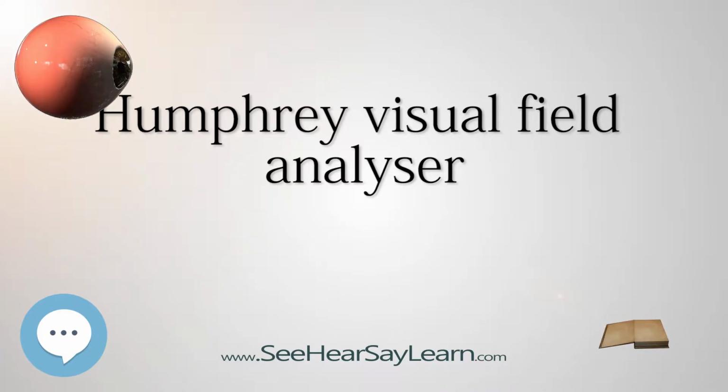Therefore, it provides information regarding the location of any disease processes or lesion throughout the visual pathway. This guides and contributes to the diagnosis of the condition affecting the patient's vision. These results are stored and used for monitoring the progression of vision loss and the patient's condition.